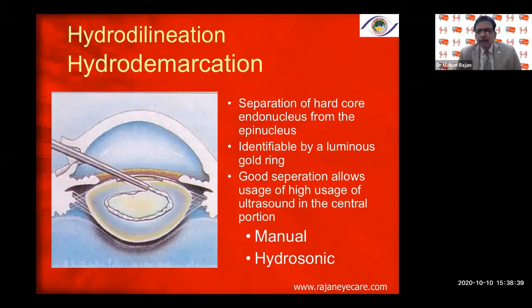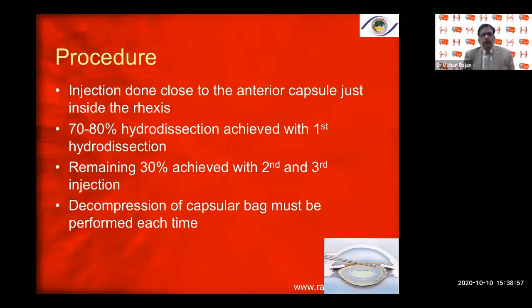Hydrodelineation is identified by a luminous golden ring — good separation allows high ultrasound usage in the central portion. The epinucleus acts as a cushion while the nucleus is being removed. The injection is done close to the anterior capsule just inside the rhexis. About 70–80% of hydrodissection is achieved with the first injection; the remaining 30% is achieved with the second and third injections. Multiple-quadrant hydrodissection is always done.